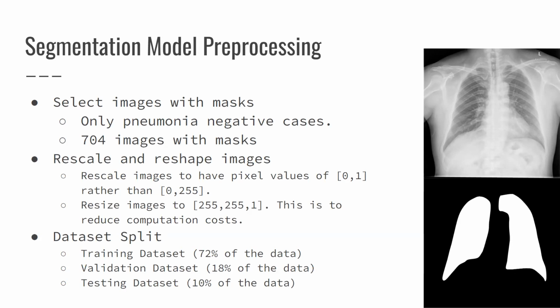That's less resolution. That is correct. I have less resolution in these 255 by 255 by 1 images, which means they're not as good a representation of the patient's chest, but they're a whole lot fewer pixels to compute on my GPU, and I need to reduce the size of these images to actually do the training on my GPU. So that's a trade-off I had to make.